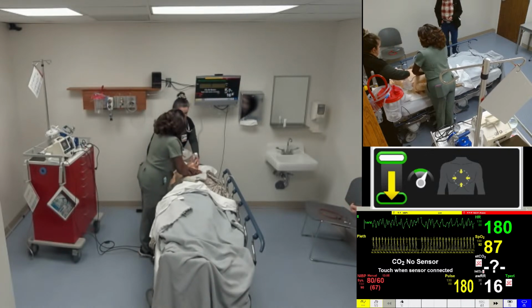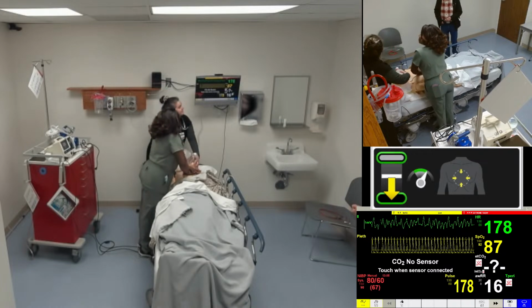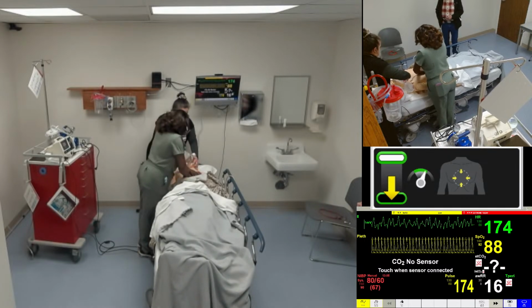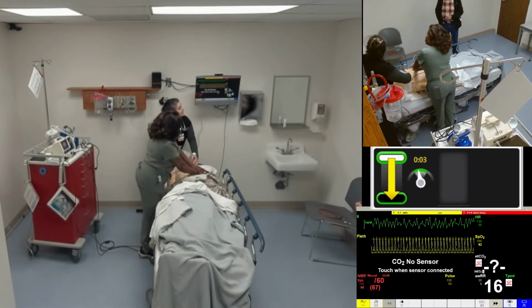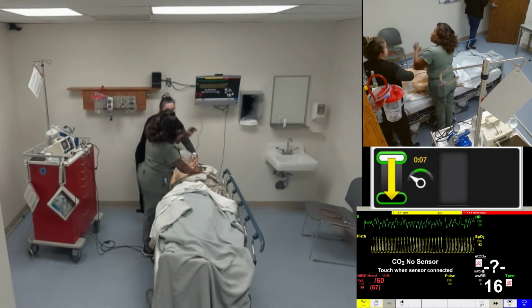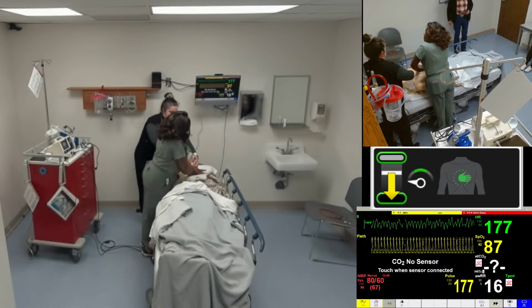Let me know when. What's your plan from here? Just shock again. Oh, we check after 1 minute. No. To get CPR, you get 45 seconds. Okay, friends, I'm gonna give you some clues. Keep doing CPR. So what is the rhythm that you guys identified?